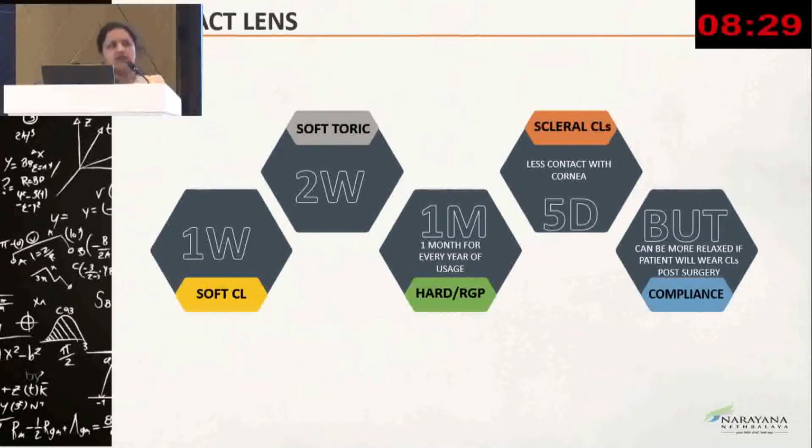We all know the dependence of keratoconus patients on contact lenses, but chronic usage of contact lenses causes warpage, which will interfere with our topography. There is no hard and fast rule, and each surgeon differs with the contact lens holiday which is required for all the calculations. This is just a rough guide which can be followed.